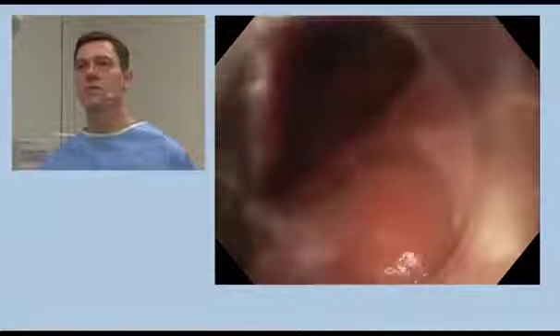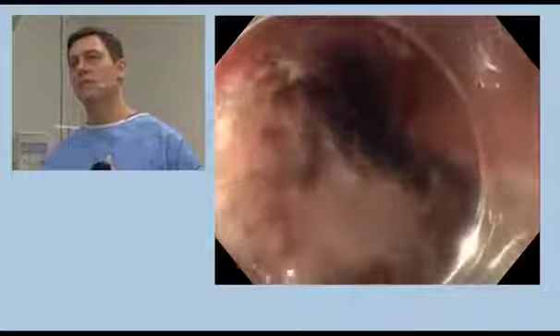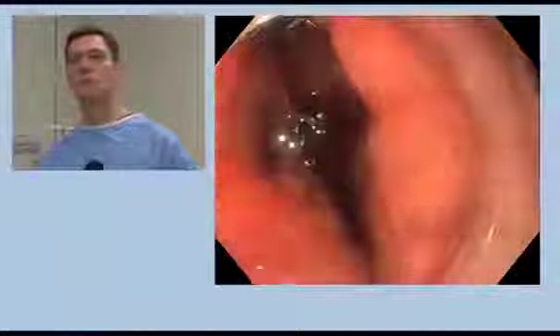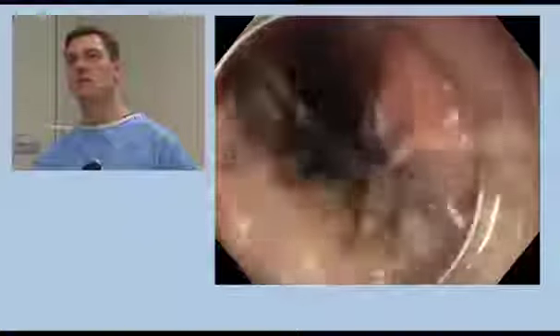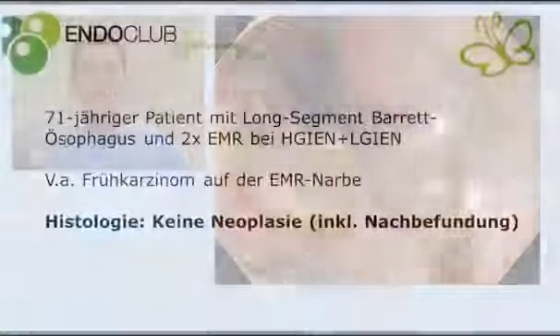We're very, very pleased with the result. You can see this constriction here. And from there, I think you can see how cicatricial it all really is. We've dissected the whole area out cleanly. And I don't think there's any further work we need to do here. There are no large vessels anymore now. Down here is where the bleeding was. We had to work with the coag forceps a bit as well. We are very pleased indeed, and we think we've had a good solution for the patient.